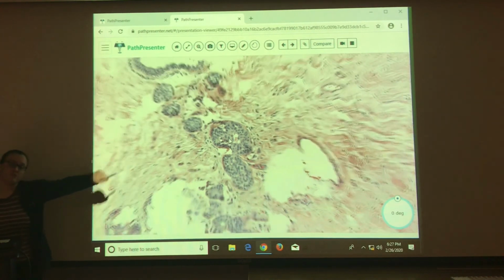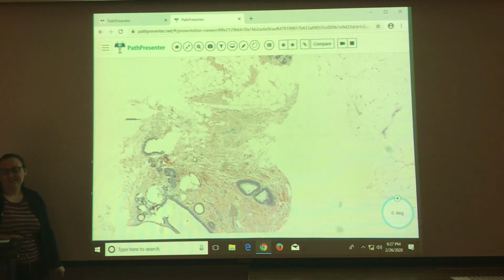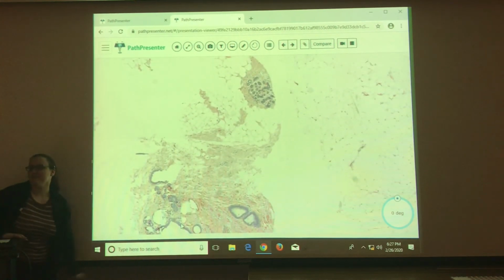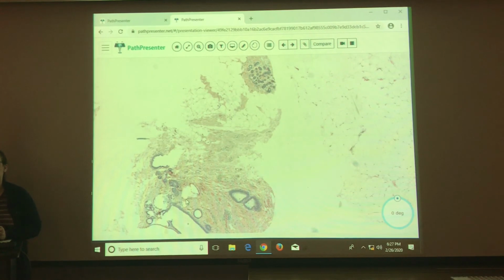Okay, so compared to our normal, what's the definition of ALH? It's just a little bit of expansion of the lobules. So I was looking for more discohesive. Yeah, you're right. Okay, so yeah, I feel better. Okay, I'm not crazy. At least I know about that, right? I mean, it's assuming that's not a, you know. Right, right. But okay, that's the best guess.